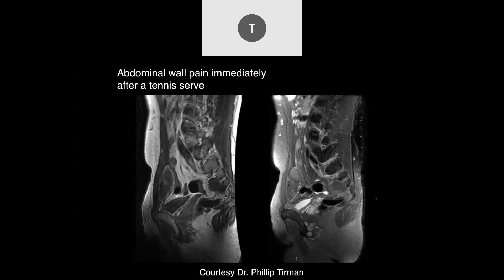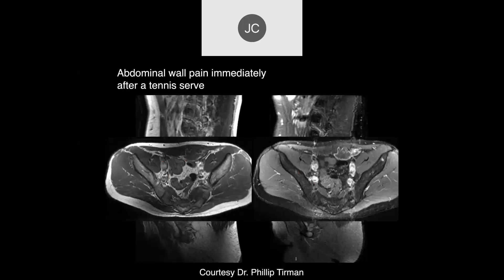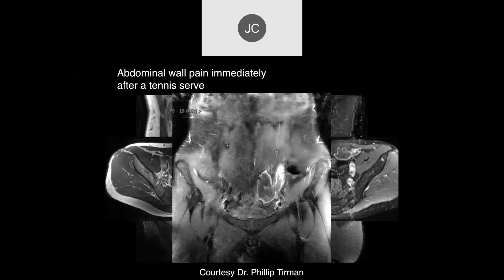Abdominal wall pain immediately after the serve. It looks like there's a fluid collection deep to the rectus abdominis musculature. It has a little bit of high signal intensity rim. The central part of the lesion looks very much like muscle in signal intensity — this is very characteristic of an acute hematoma. You're just starting to get some oxidation of the hemoglobin around the rim. On the coronal plane we can see the nature of the hematoma within the rectus abdominis muscle.